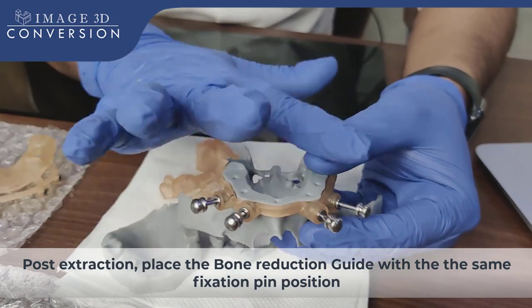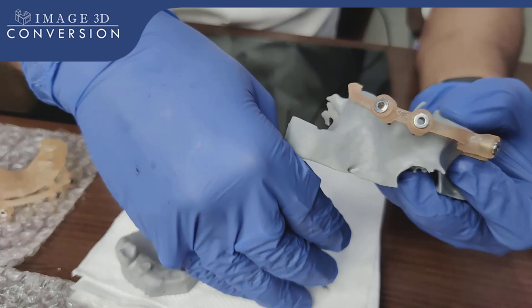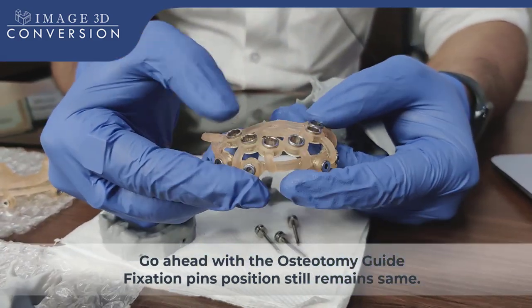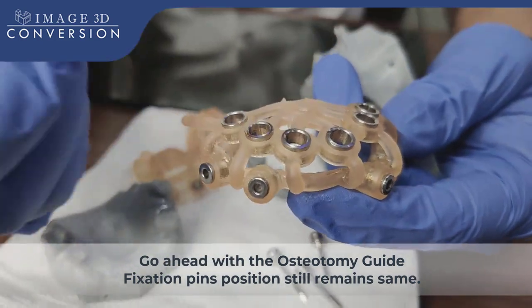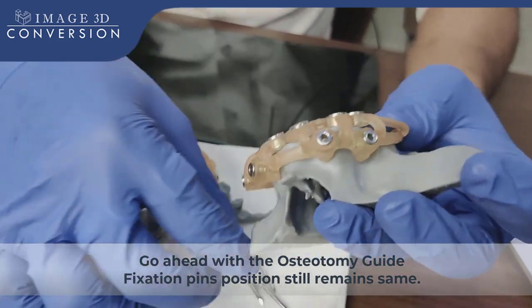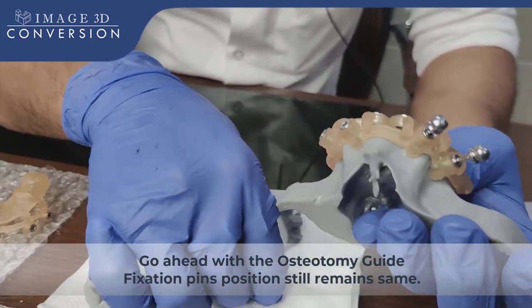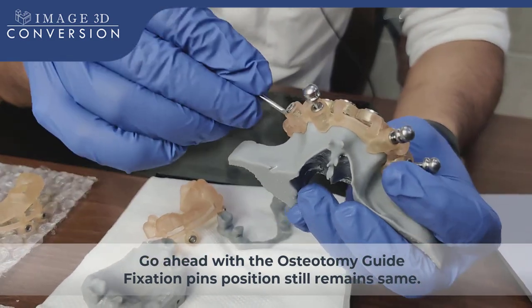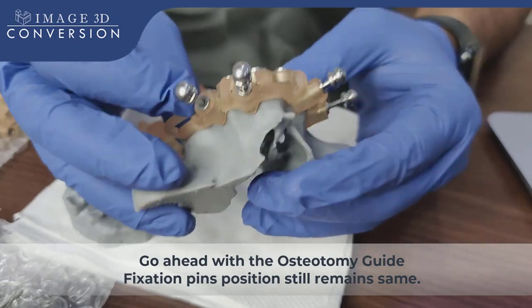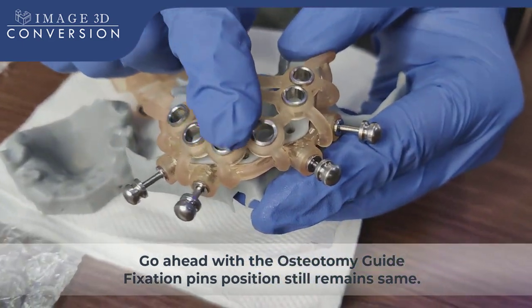This is the dummy model we are sharing. Once you see the reduction is well-defined and the guide is working properly, you just need to remove this surgical guide and fixation pin. Then with the same fixation pin position, another guide — this is the implant placement guide. We planned this surgical guide with the Dentium fully guided kit. With the same fixation pin, we are stabilizing the surgical guide with the same indexing position achieved through the tooth-supported surgical guide. Now you see it is sitting properly, stabilization is good.